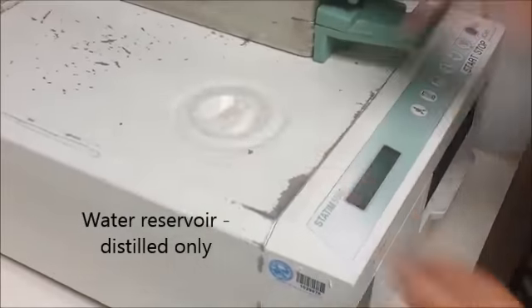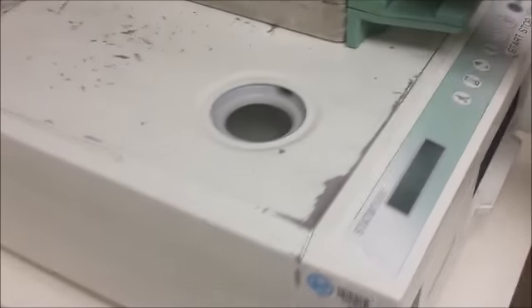The water reservoir is right on the top here. You simply lift that cover and that's where you'll be filling the distilled water.